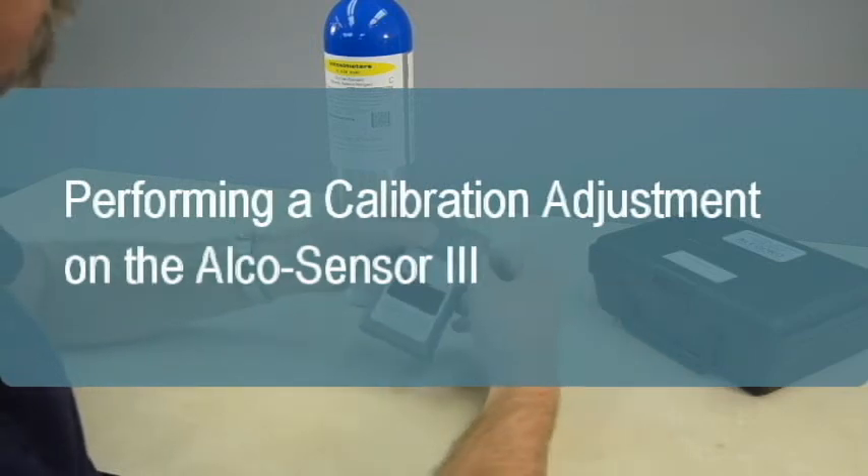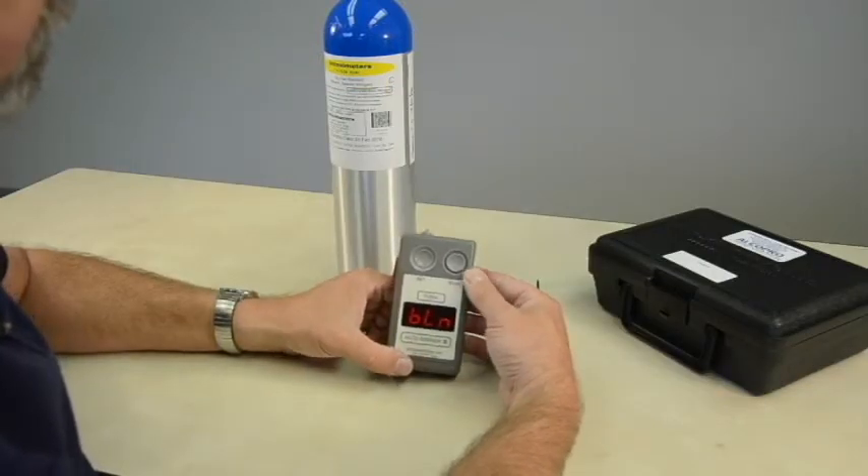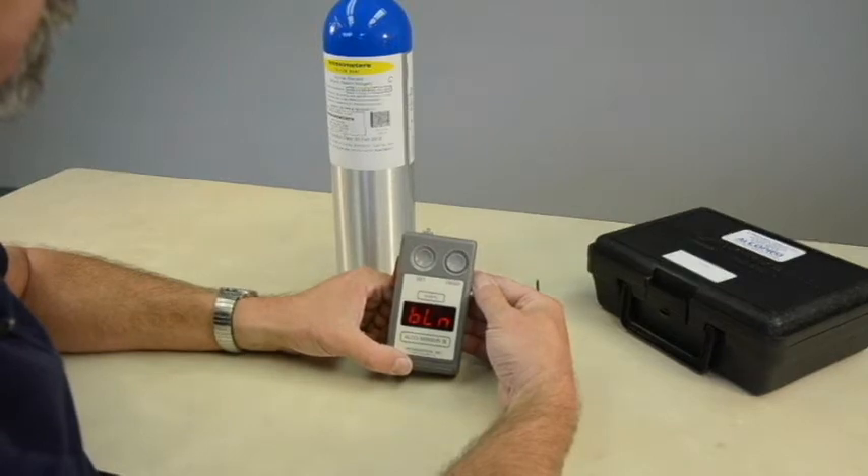The AlkaSensor 3 instruments typically hold their calibration for months or even years without needing adjustment. Intoximeters does not require that the instruments be periodically calibrated. A calibration adjustment need only be performed if an accuracy check on the instrument has failed.